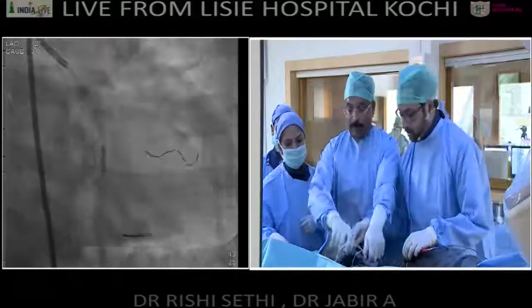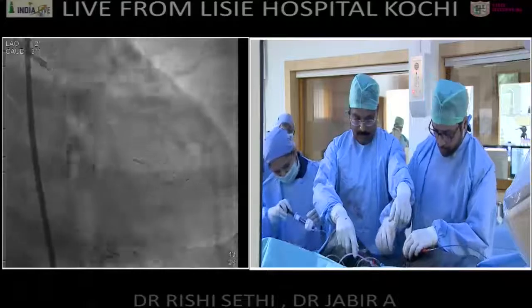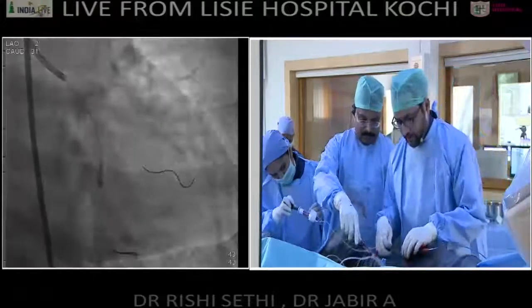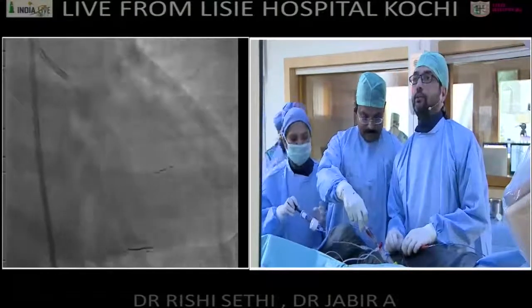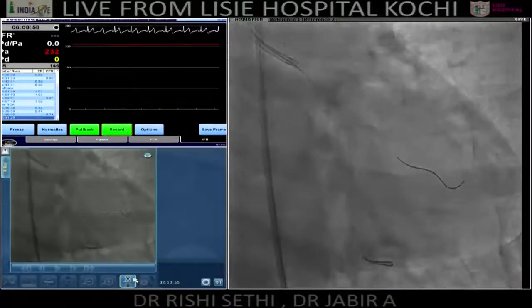Okay. Now the FFR wire. Okay. So we'll try to quickly put an FFR wire down and see what we get. Be ready with that. If I am not able to tell you right now because of shortage of time, surely I'll tell you all tomorrow when we meet in Delhi.